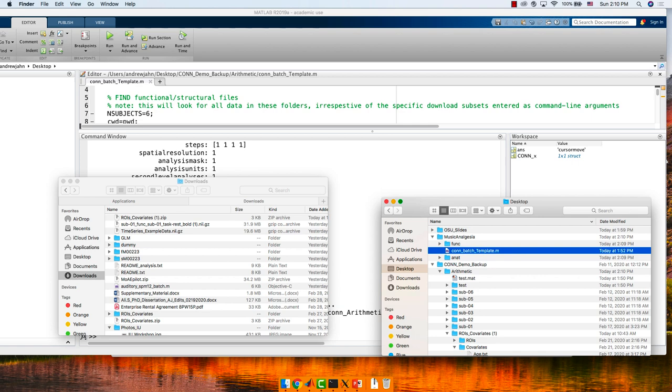Take a minute — I want to make sure we're all at the same location. We have a new folder on our desktop called music_analgesia, with a func directory and an anat directory containing the corresponding functional and anatomical files.